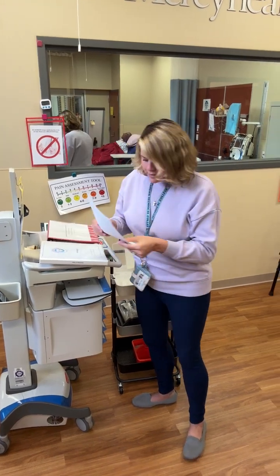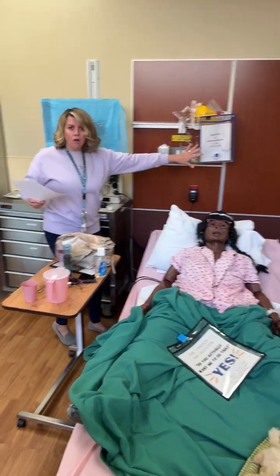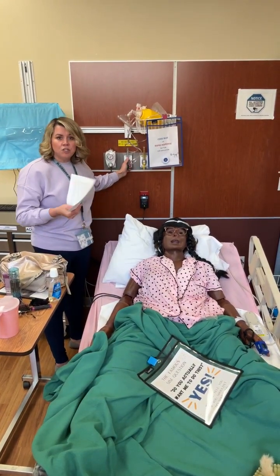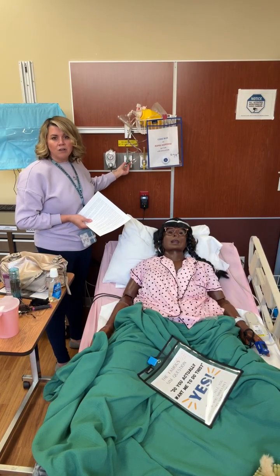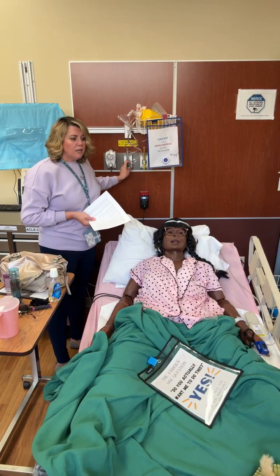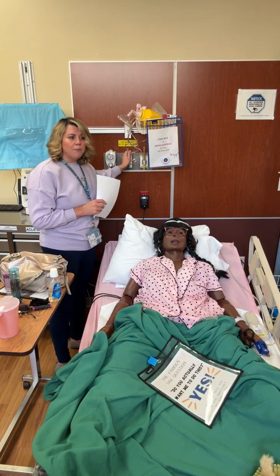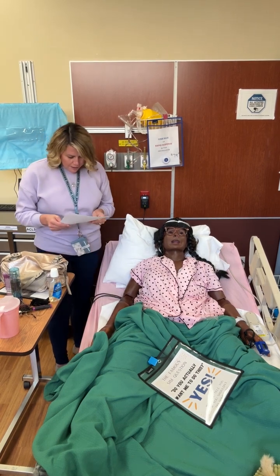The head walls in the sim lab, they function and work like they're supposed to. So this is called a head wall. The head walls have basically what you're going to need for oxygen and air and suction. So if your patient needed oxygen, you would get a cannula, hook it up to the oxygen, and then turn it on to wherever it needs to be. In other videos on our Sim Lab how-to series, we go over how to use the flow meter on the head wall. So if you need to review that, go ahead and do that. But just so you know, everything is functioning for Carla Rogers.